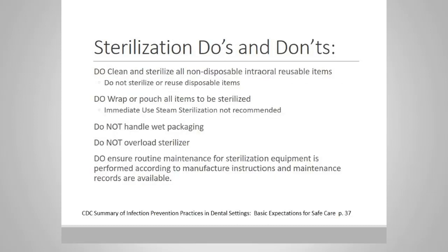Here are some sterilizer do's and don'ts. Do clean and sterilize all non-disposable intraoral reusable items. Do not sterilize or reuse disposable items. Do wrap or pouch all items to be sterilized. Do not handle wet packaging.